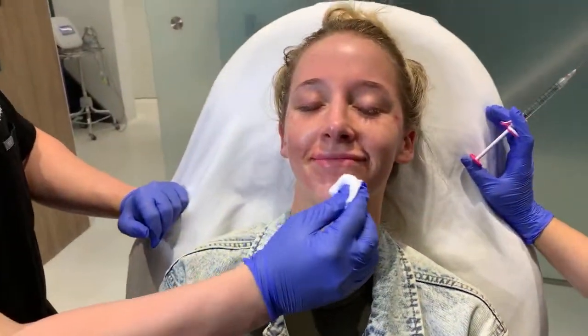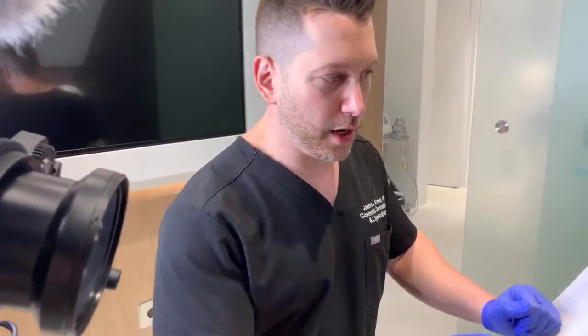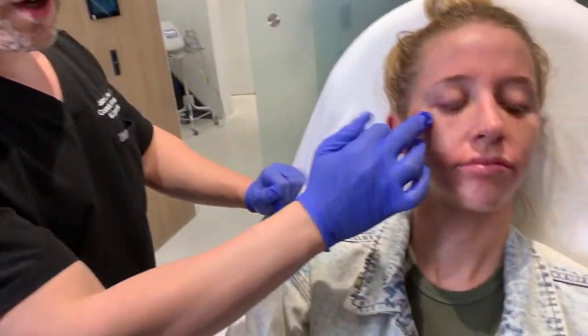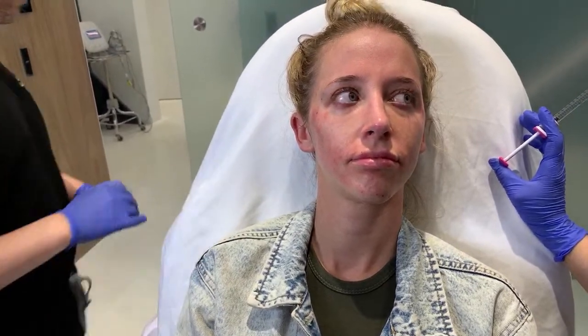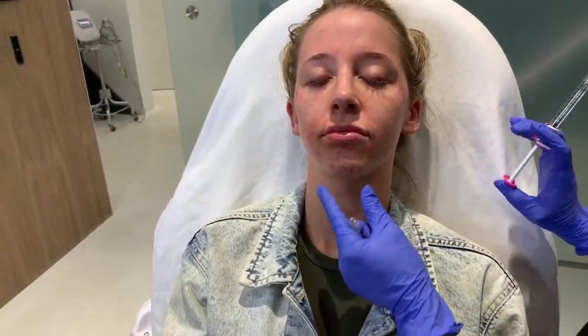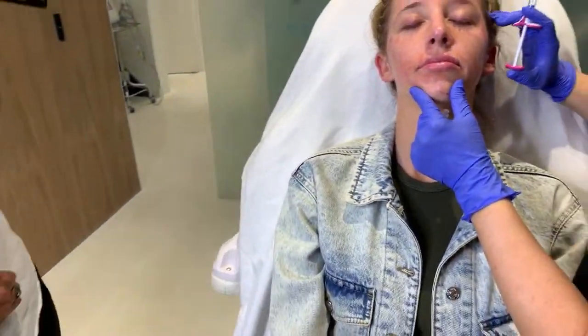All right, so now Danielle's gonna use a cannula, guys. We're gonna do cannula because we wanna prevent bruising, and she has a very deep set trough, so by using the cannula, you can go a little higher with much less risk. I'm just gonna measure first. Just look up to the ceiling, just with your eyes. She's deep. I'm gonna inject one spot in her temple.